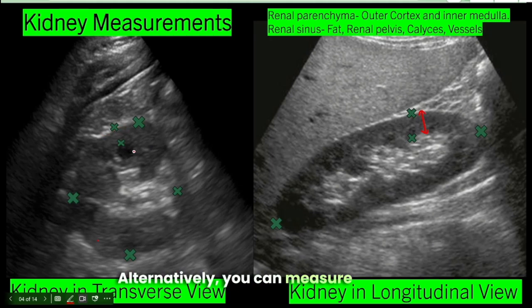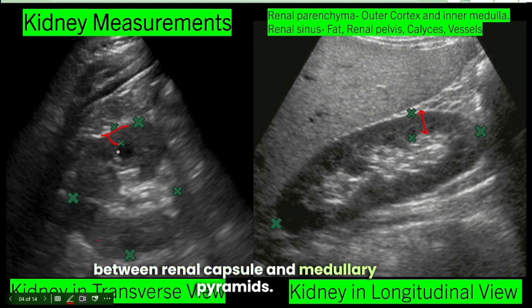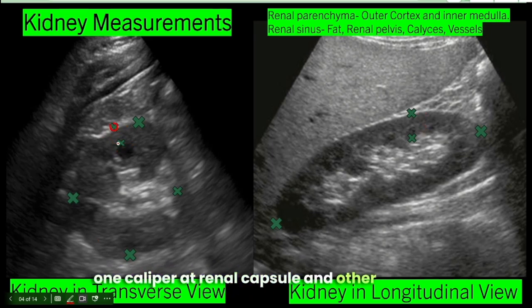Alternatively, you can measure renal cortical thickness. Renal cortex is slightly hyperechoic area in between renal capsule and medullary pyramids. You can measure cortical thickness by putting one caliper at renal capsule and other at the outer margin of the medullary pyramids. Normal cortical thickness is around 6 mm.